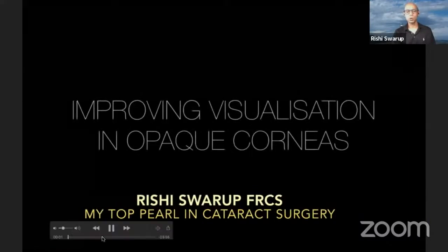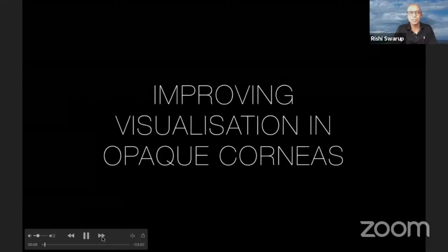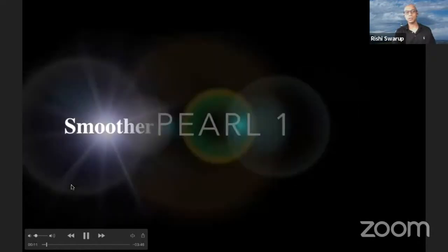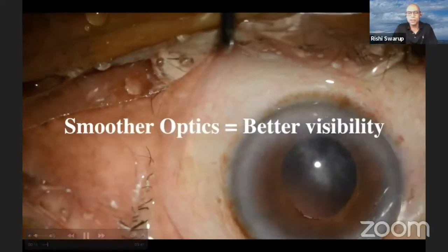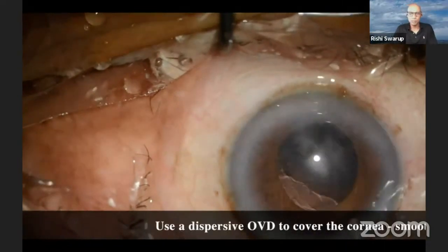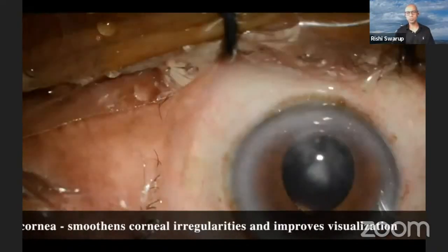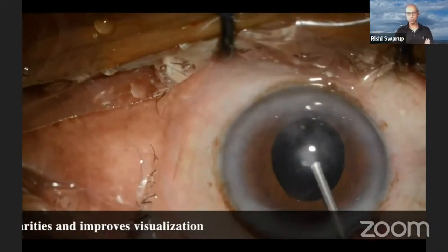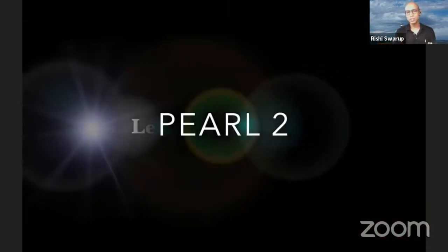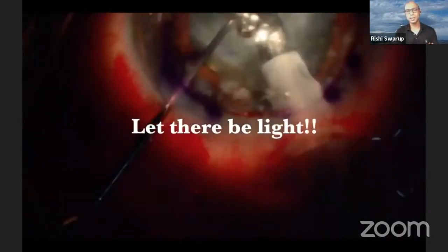Okay. So I'm just going to give you some tips on how to improve your visualization in opaque corneas. I'm a cornea specialist, so this is my area of interest. Now, I'm just going to give you a few simple tips. One is, often we have these opacities on the cornea. Of course, this opacity is not very irregular, but sometimes you have very bad irregular surfaces along with the opacity, and just putting a small dispersive viscoelastic dollop on top of the cornea can significantly improve your visualization by smoothing the surface. So smoothen the surface with a dispersive viscoelastic.